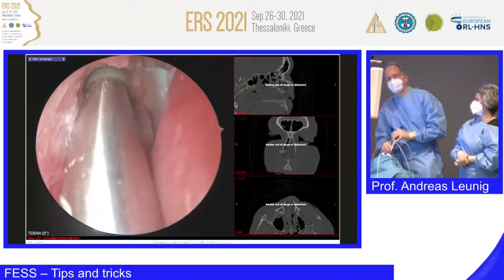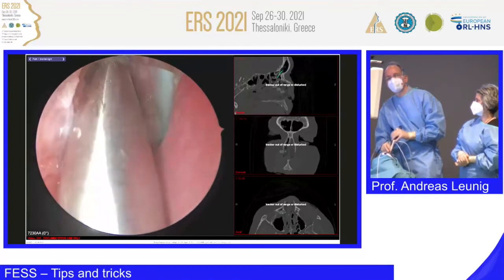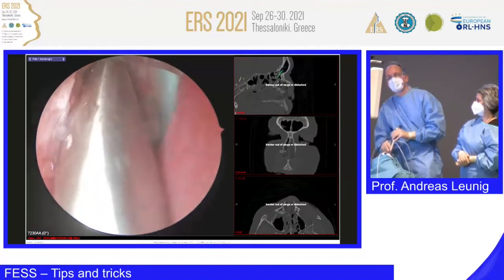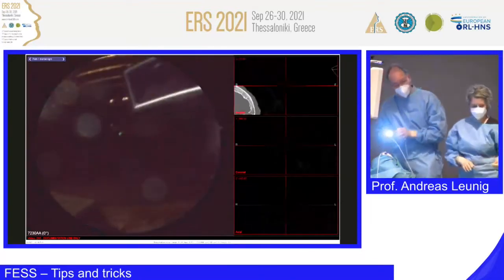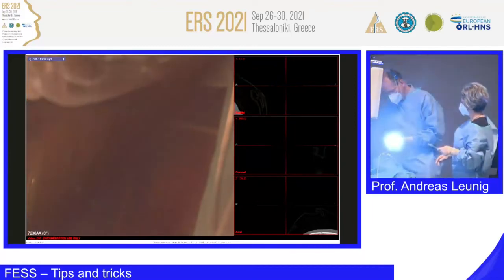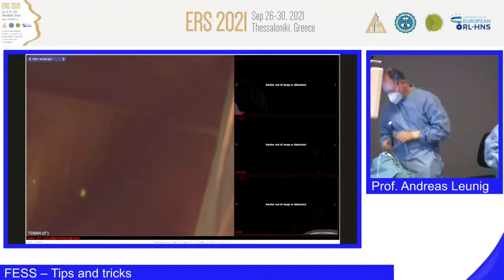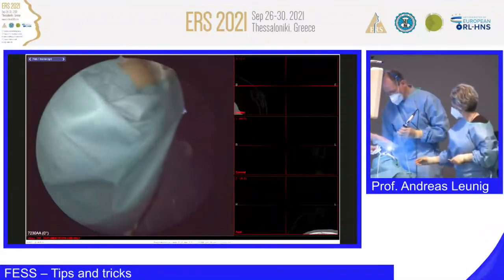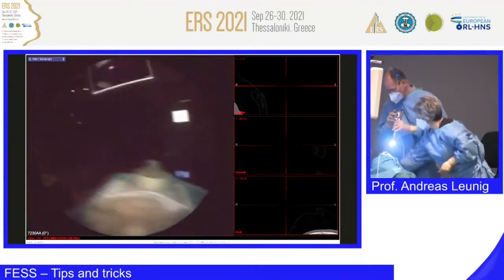Coming closer, getting more opening, more access, a beautiful access opening in a very complex anatomy, I think. Okay, I still have the 0 degree endoscope, but now I'm switching to the 45. There are two different ways how you can approach the frontal sinus with a drill. It's the line of sight approach, the direct way, which I showed you just now, or, and this is what I prefer as well, the around the corner approach.